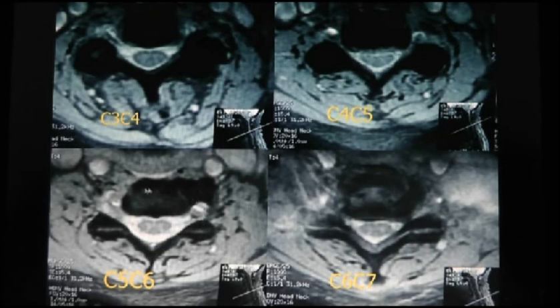So what do you think of C5-C6? It looks very good, very healthy. And C6-C7? C6-C7 is narrowed. Some of it is from the ligamentum flavum posteriorly as well. Here's the ligamentum flavum. Now, here it's hard to talk about the foramen exactly because of what cut it is. Maybe if you were a slice above or a slice below, it would open up. But maybe you're too close to the pedicle, right? And you're not in the middle, right?